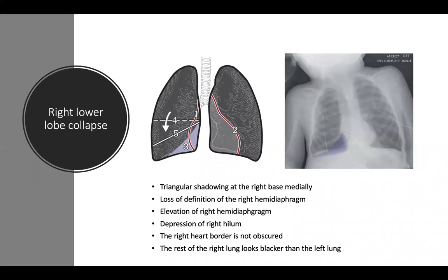That was an example of right lower lobe collapse. Features include triangular shadowing at the right base medially, loss of definition of the right hemidiaphragm, elevation of the right hemidiaphragm, depression of the right hilum, the right heart border is not obscured, and the rest of the right lung looks blacker than the left. The diagram shows: one — right heart border, two — left heart border, three — triangular shadowing, four — normal horizontal fissure, five — horizontal fissure displaced downwards. The radiograph shows the collapsed right lower lobe in purple.